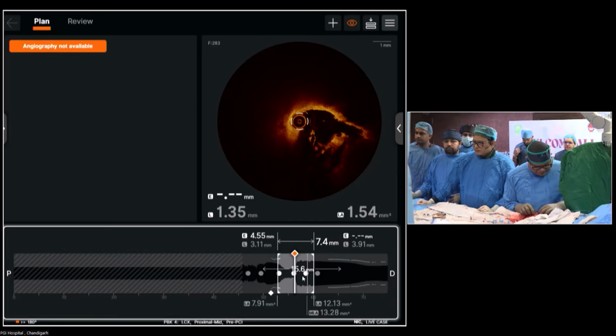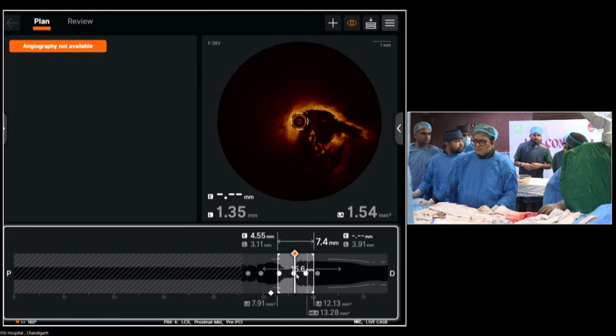And yes, stent. So if you stretch that out a little bit more, you end up with something near to 7. But obviously I've seen that you're stenting.